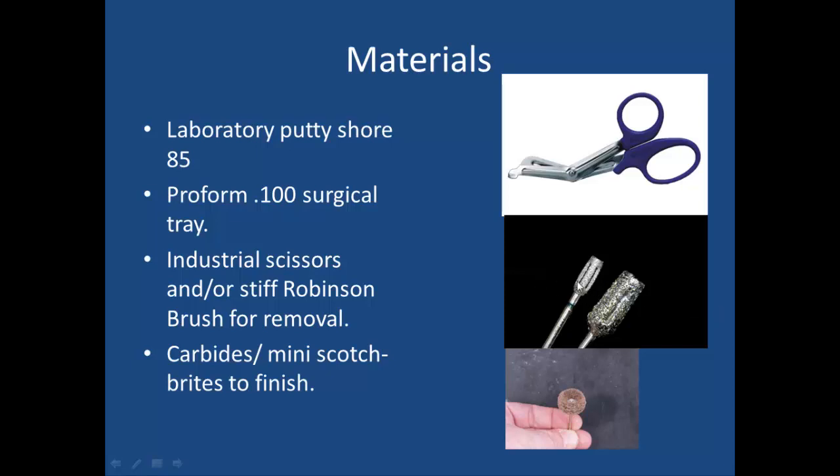Considering that vacuum form material is thermally formed with heat, friction is heat, so we want to use something slow speed that cuts and doesn't melt the product. Final finishing and contouring is done with mini Scotch-Brite wheels — coarse, medium, and fine. You can also pumice and polish this material if you want to get a high gloss off the borders. These are the products I'd basically recommend for the procedure.